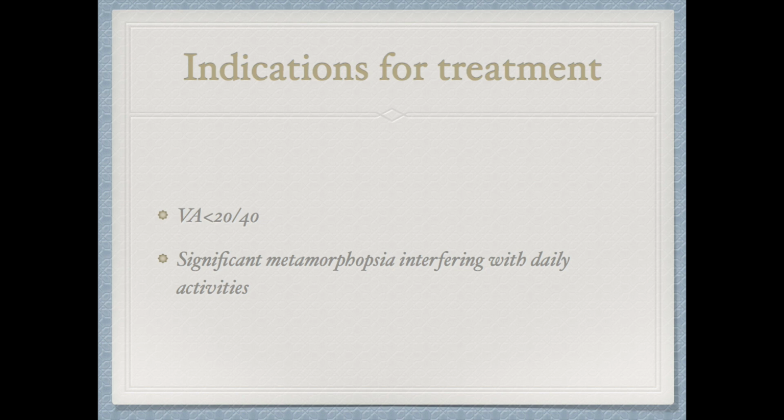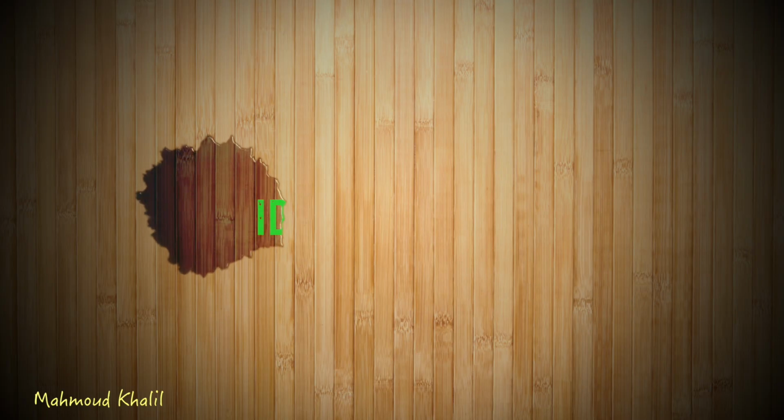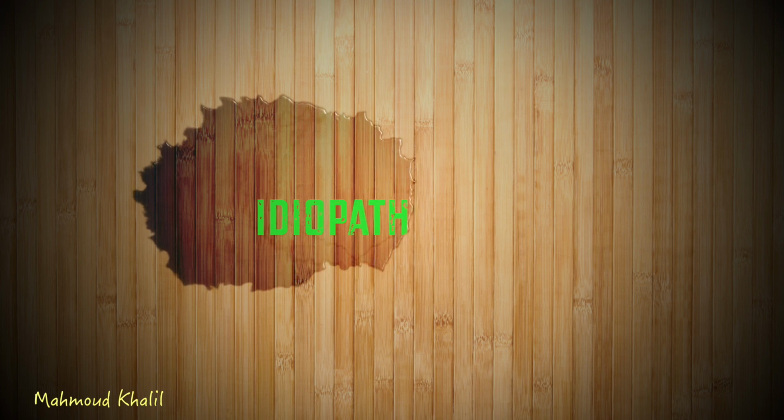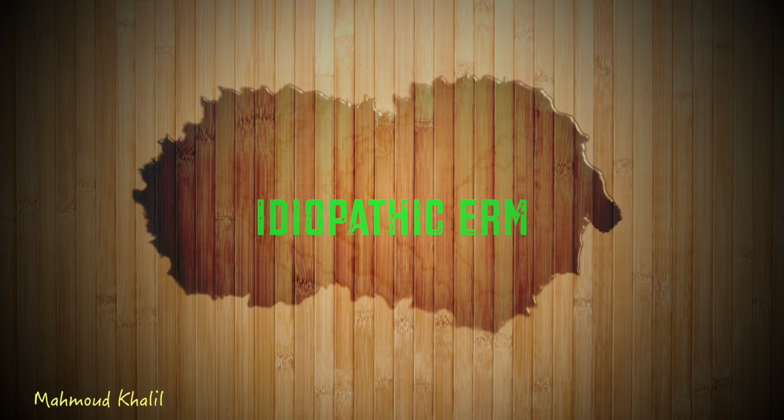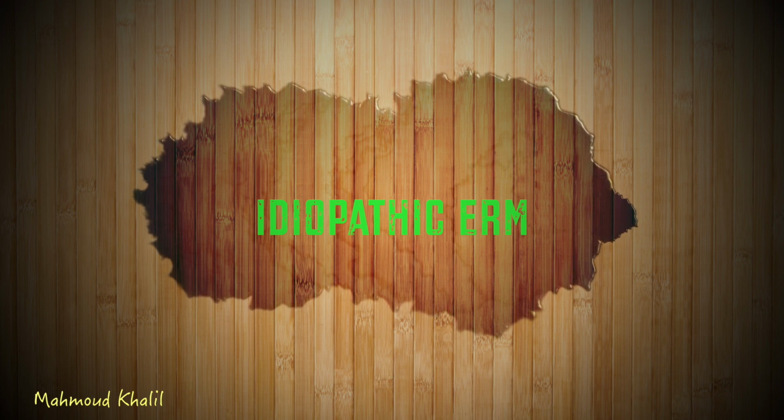So, what are the indications for treatment of an epiretinal membrane? The indications are functional. The first indication is best-corrected visual acuity less than 20/40. Also, if there is significant metamorphopsia interfering with daily activities of the patient. Now, there are video examples of different causes of an epiretinal membrane. The first cause and the most common cause is an idiopathic epiretinal membrane.